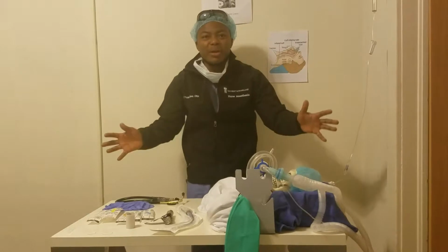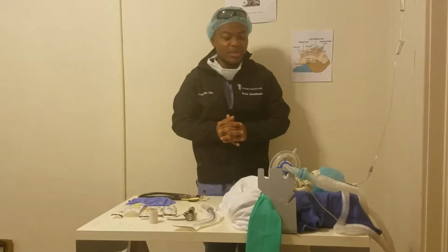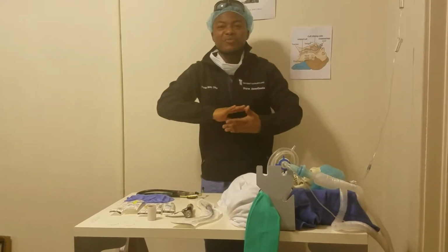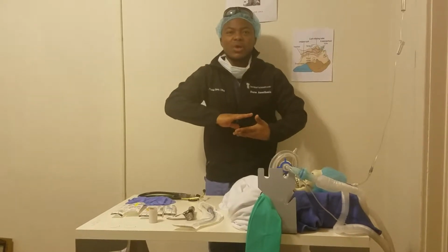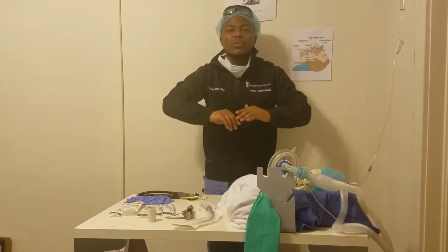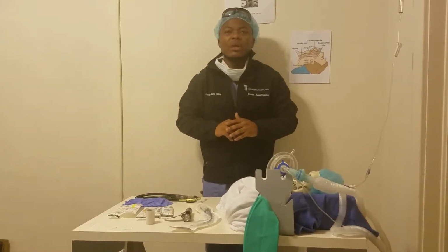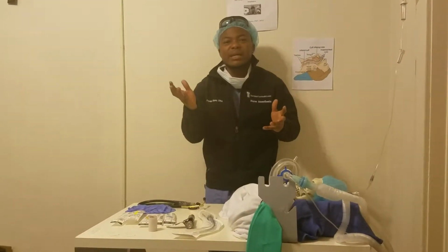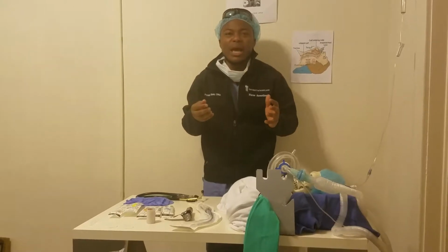Once we have our preparation done, the next thing is we go ahead and have our patient positioned. So patient positioning requires that the head of the patient be placed approximately at the xiphoid process. In addition to that height, we also try to have the patient's head turned backwards. Turning it backwards puts it in a sniffing position, which helps align three axes: oropharyngeal, pharyngeal, and laryngeal axis.